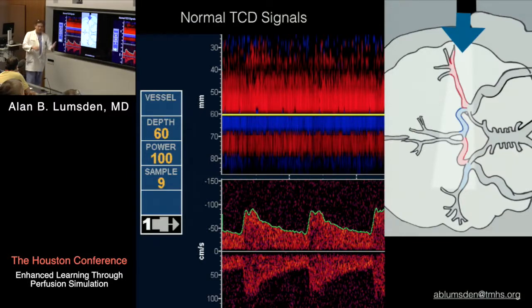Forget that at the moment. Is it of value to know that you're perfusing the brain? This is kind of that lawyer question again. Is it better to know you're perfusing the brain or not know? All right, and if we knew what the baseline was, do you think that would be helpful? That's a different kind of question actually. That may not be the right question.